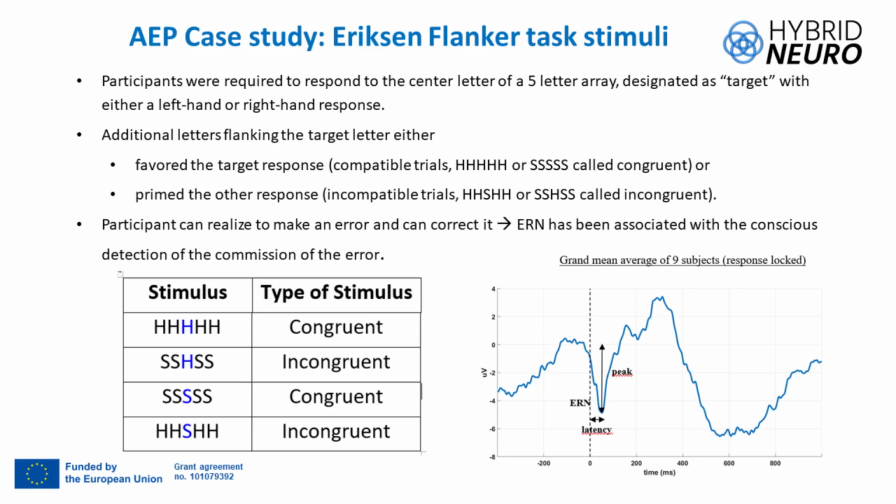Because when you press the button, for example, with your left or your right hand, very quickly you realize that, okay, I'm wrong, and you correct. So you have to align, not with respect to the stimulus, but the response. This is the latency, and it's very short. Okay, this is the ERN.